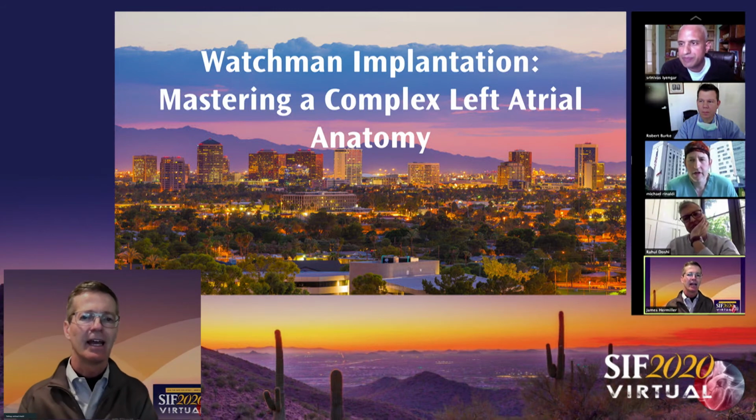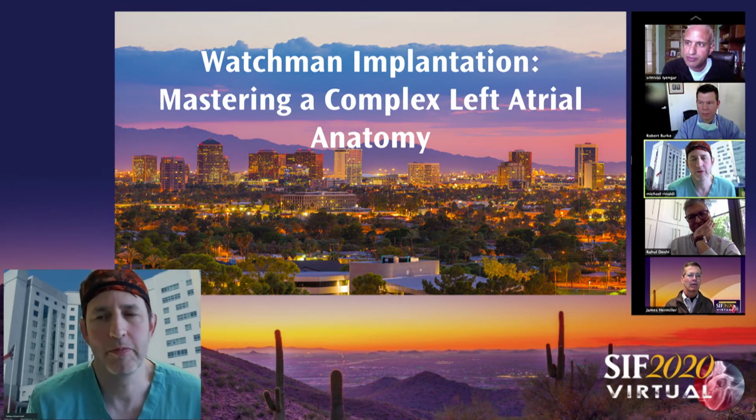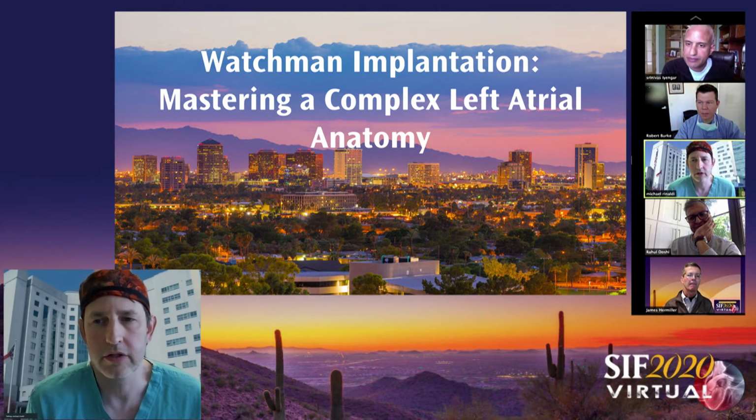Yeah, I like the concept of changing the angle of attack with the sheath change. I'm just actually still baffled and perplexed that the septum that was there sort of gave way and you had full feet expansion. I might have thought that it wouldn't have expanded, and I would have been completely wrong. So the appendage humbles me all the time. I always think I know what's going to happen, and then something different happens.